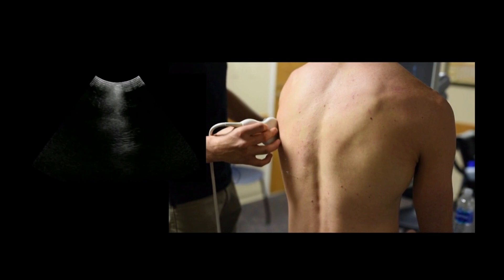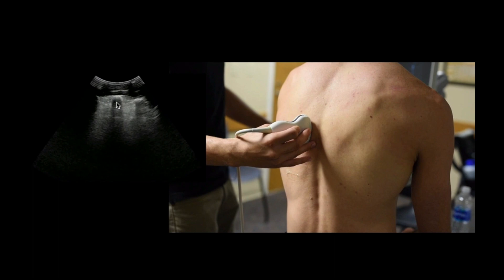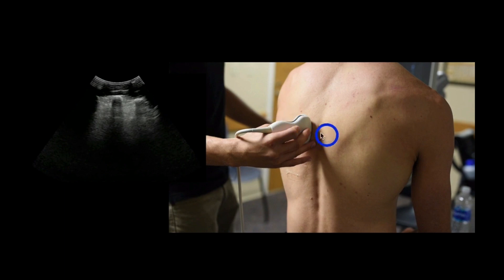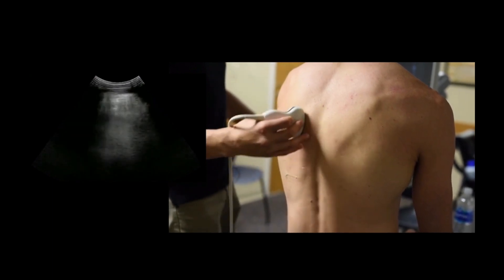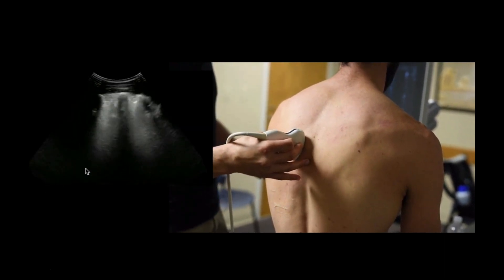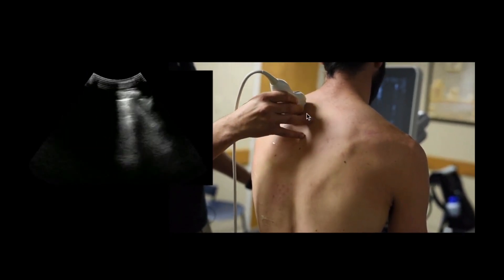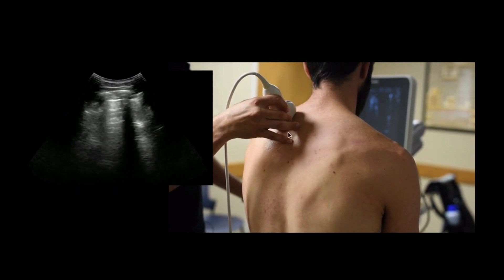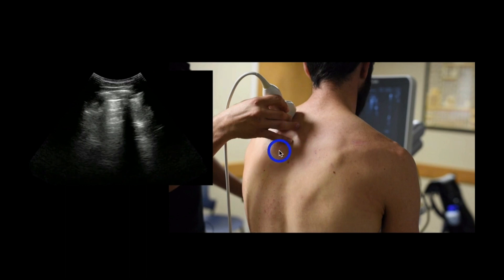Right here is the transverse process of the spine — that's the medial border when scanning the lungs. I go between there and, when under the scapula, out to the posterior axillary line, then back and forth. When you get higher up, the area you can evaluate narrows because the scapula gets in the way, so just lawnmower in that small area. You can actually go up higher than you might think, and I've found pneumonias only visible back here. Having the patient hunch their shoulders forward with arms crossed moves the scapula out of the way for better visualization.